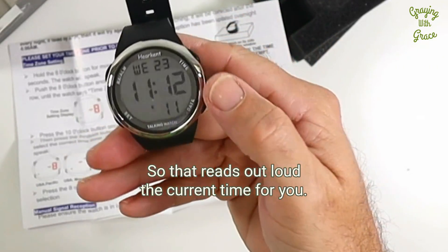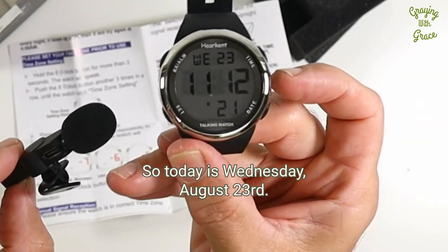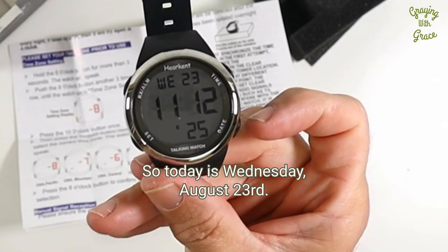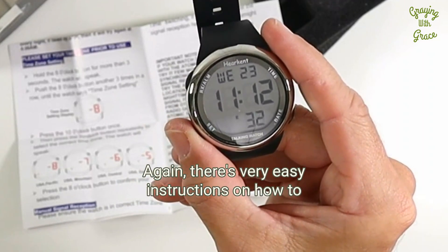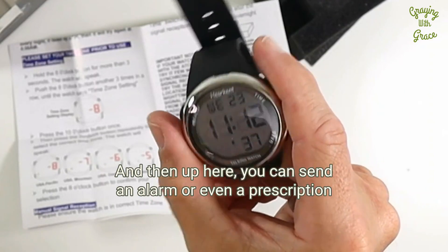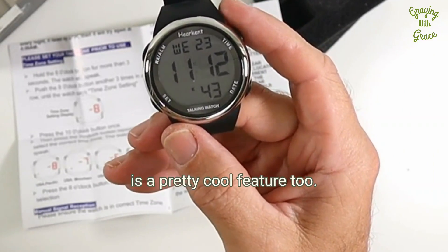This button will tell you the day of the week and the date. The watch says: 'Today is Wednesday, August 23rd.' The set button is where you set your alarm and various other functions — there are easy instructions on how to do that in the manual. Up here you can also set an alarm or even a prescription reminder to remind people to take their medications, which is a pretty cool feature.